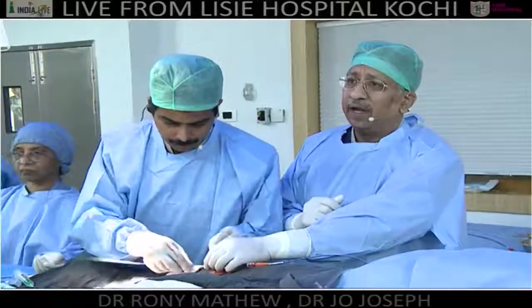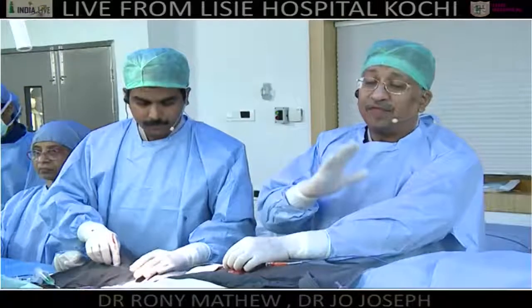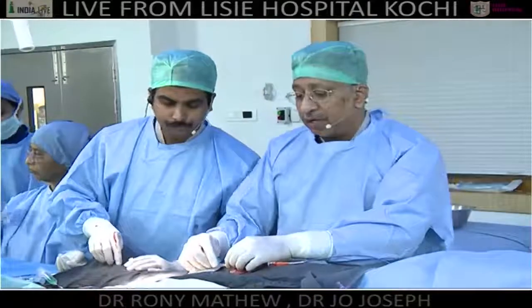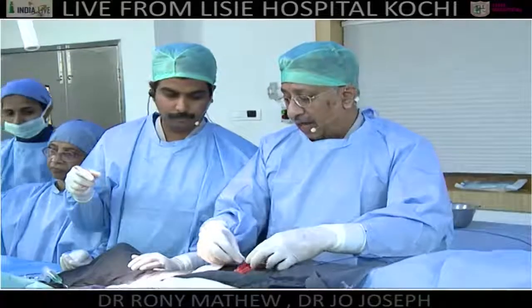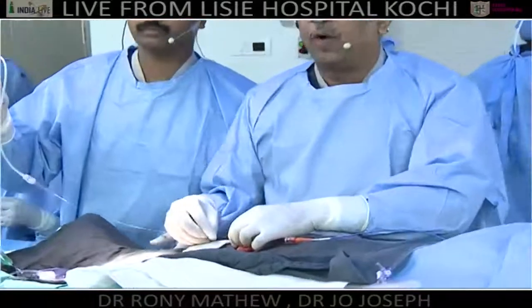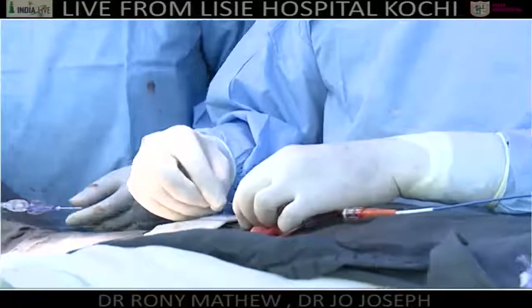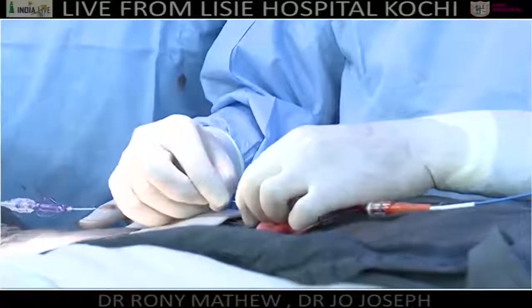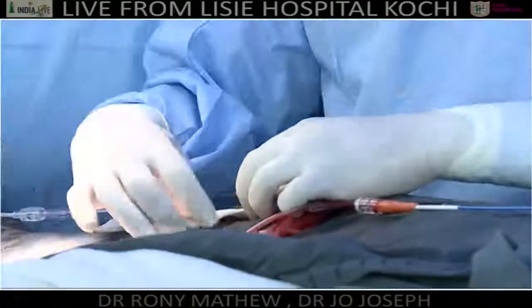If there is a lipid arc of more than about 120 degrees, you can be pretty sure that your side branch will occlude. And it also tells a lot about the struts and wires, especially when you get stuck during bifurcation and your balloon doesn't go in, you will know exactly what the problem is. So I don't think you require it all the time, but when you do need it, it does help you out.